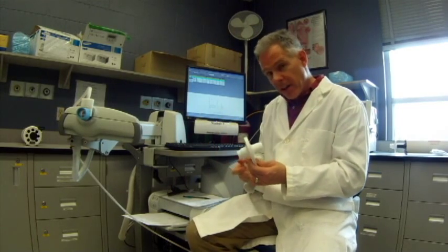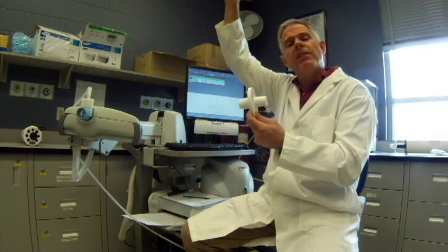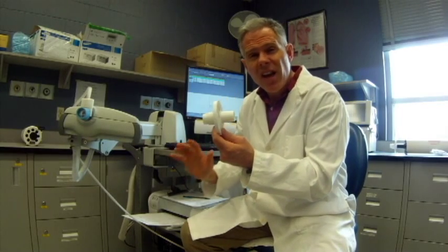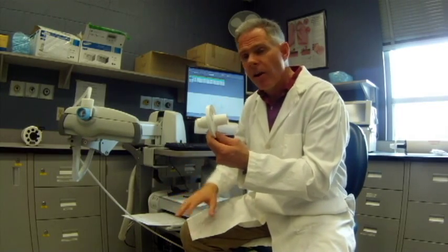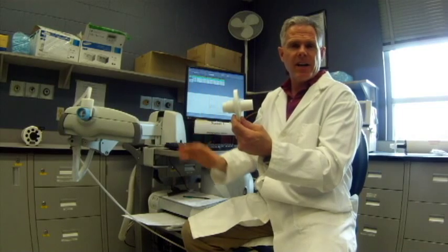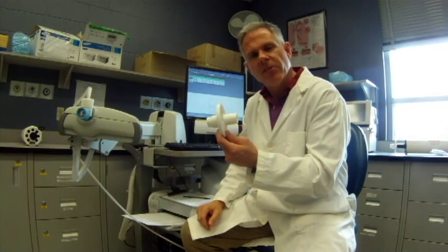The slow vital capacity test is quite simple. We have the patient breathe nice and gently to establish their FRC — their functional residual capacity. When they're ready, coach them to take a big breath in, as big as they possibly can. Then have them relax and blow it out slowly, keep blowing until they've expelled all the air from their lungs as much as possible, until we see an expiratory plateau or they simply can't blow any more out. Then a nice easy breath back in again.